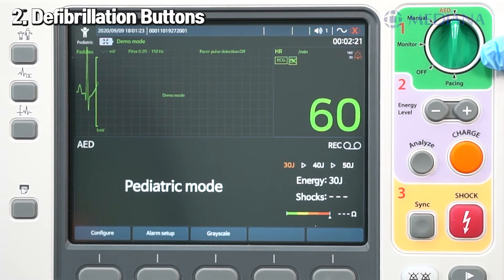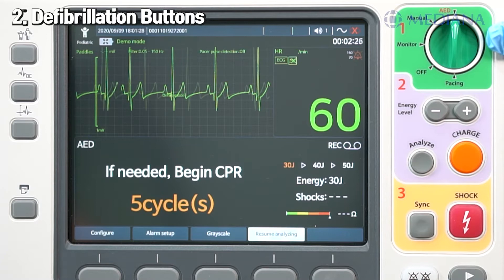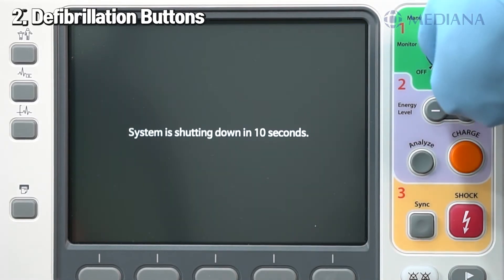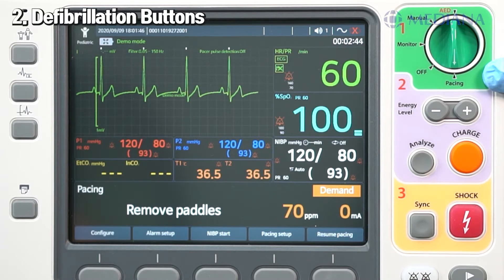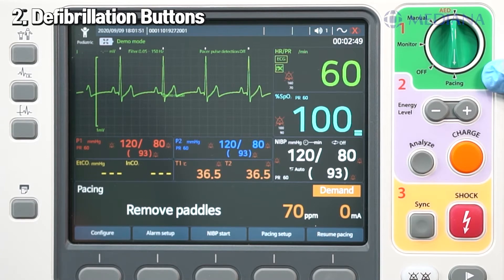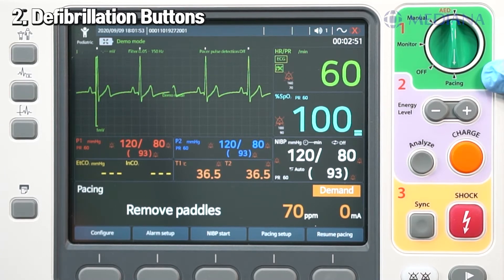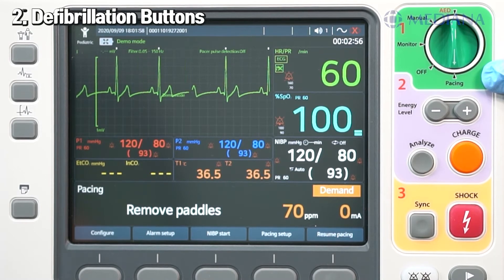By turning the knob to AED mode, it instructs step by step through audio and visual guidance. By turning the knob to pacing mode, the device can deliver pace pulses in either demand mode or fixed mode. In demand mode, the device only delivers pace pulses when the patient's heart rate is lower than the selected pacing rate. In fixed mode, the device delivers pace pulses at the selected rate.